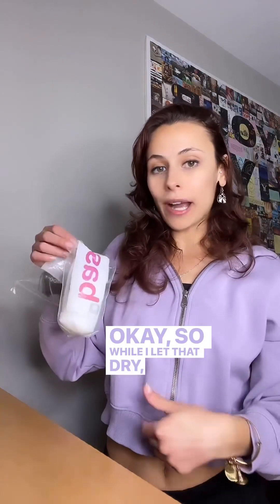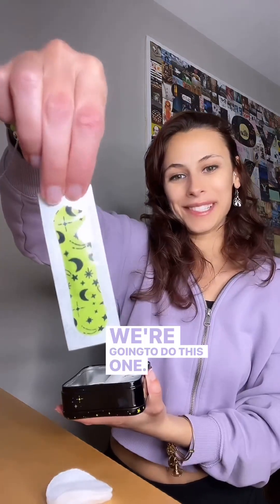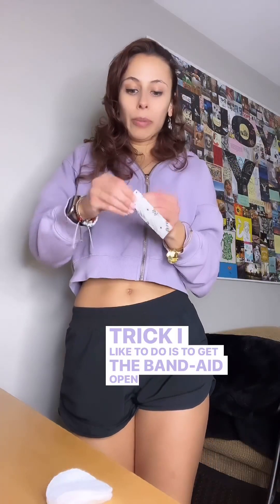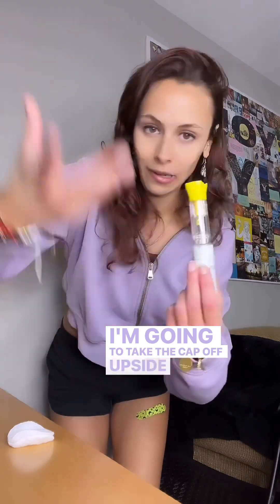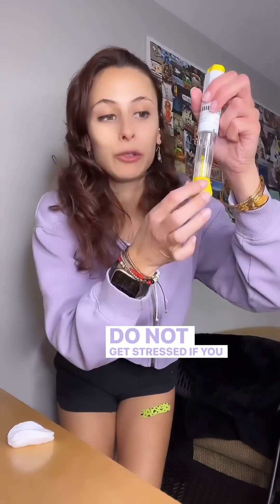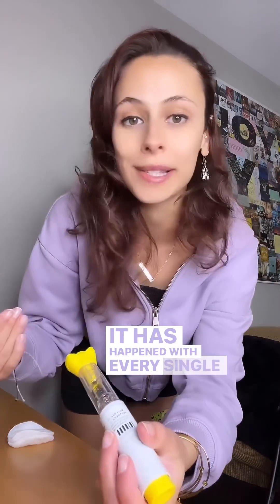While I let that dry, I'm going to get my cotton pad out and get my band-aid ready. A trick I like to do is get the band-aid open so she's ready to go. I'm going to take the cap off upside down because medication will fall out — that's completely normal. Do not get stressed if you take the cap off and see liquid fall out. It has happened with every single pen I've used.